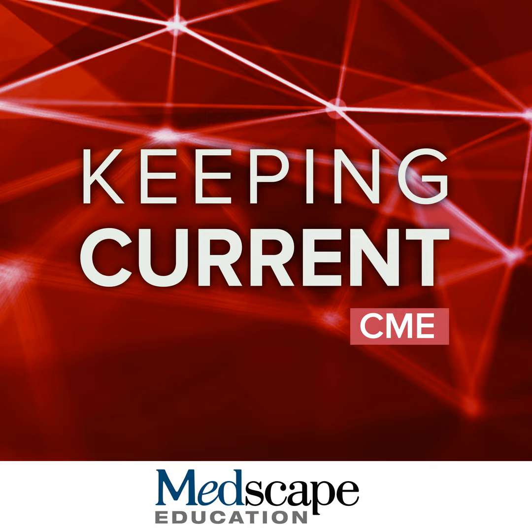And so again, the idea here is the amyloid is very, very early pathology. And so if somebody's being considered for therapy, that is probably the right one to get. Versus if somebody has more advanced disease or a complex presentation, that's where your FDG PET may be where you want to start.